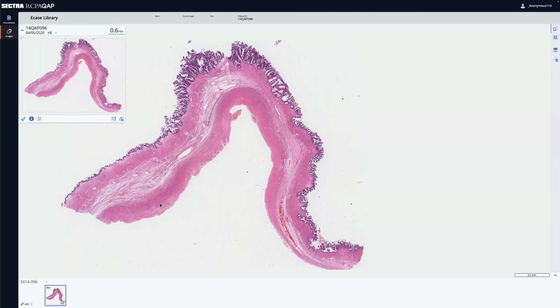When they talk about tumors having a component that needs to be more than 10% of the volume of the epithelial component, are we just sort of going around the cyst and looking for 10% of the circle, or what do they really mean by volume of epithelium? Yeah, I think you have picked up that really poor definition, right? Because we only sample the bits that look unusual, don't we? The solidy bits and the frilly bits and things.